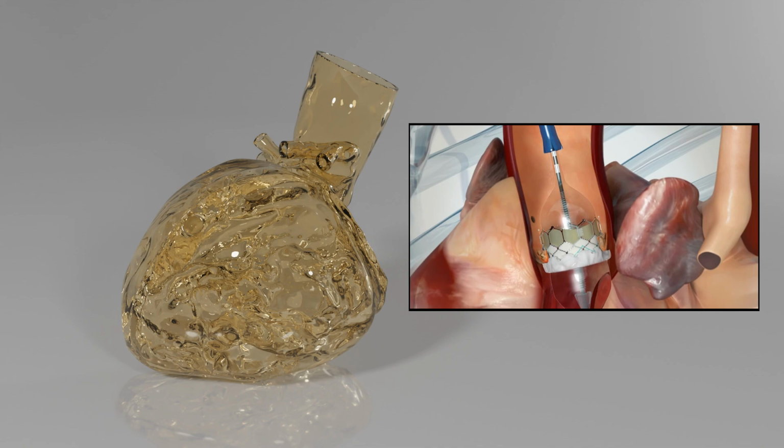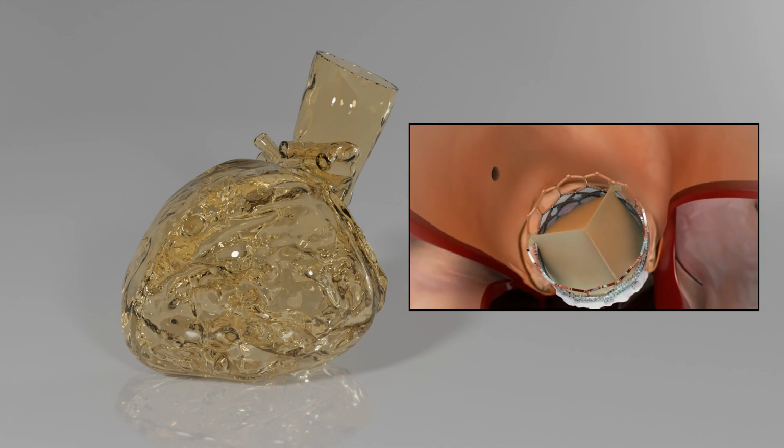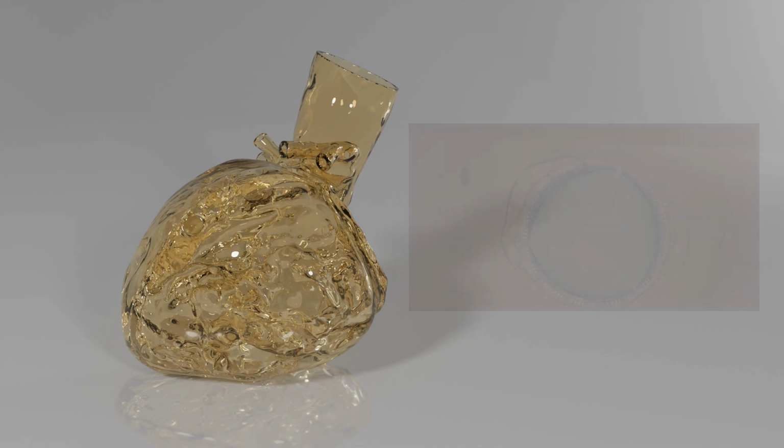The TAVR procedure is challenging because the aortic valve cannot be viewed directly, as it would be with an open surgical procedure. The surgical team only uses X-ray and ultrasound to position the new artificial aortic valve. Therefore, it is very important to have a good understanding of the patient's anatomical situation.